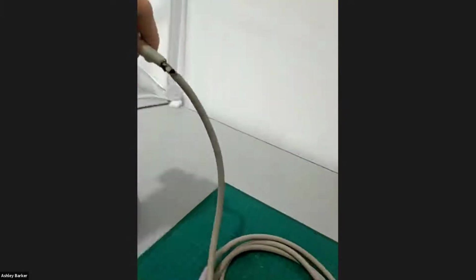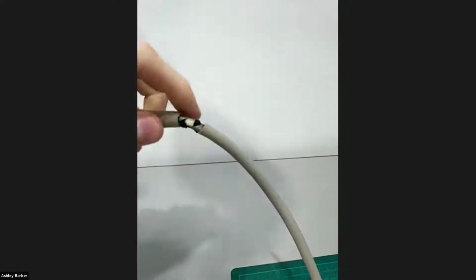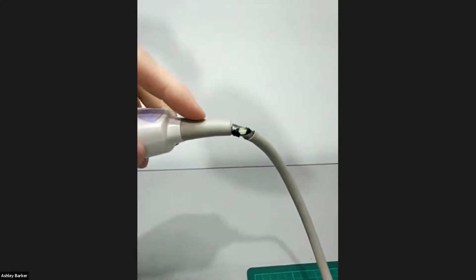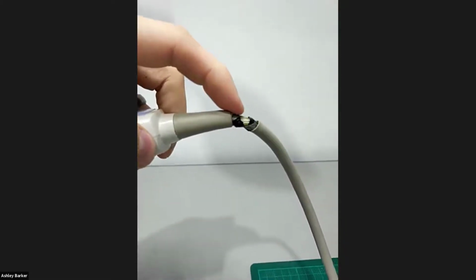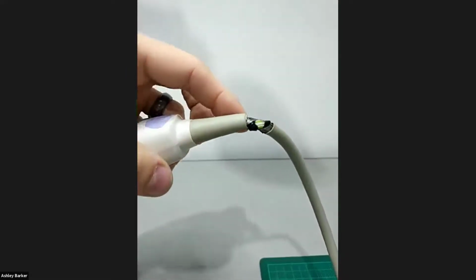Moving on here, this is sort of starting back into the more common things. So you can see, let's see if I can line that up with some good lighting, the cable is broken at the back of the strain relief. And what's almost certainly happened there is somebody has cleaned this strain relief with alcohol, which has made it rock hard. And then the only bending is happening right at this point at the end of the strain relief. And so the cable breaks and the sheath ends up pulling back.